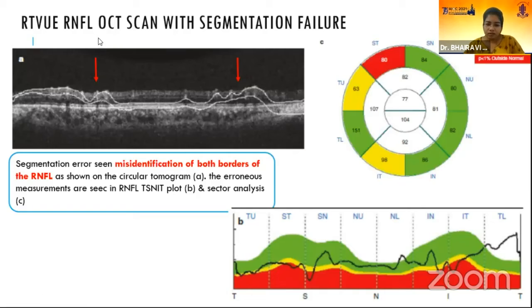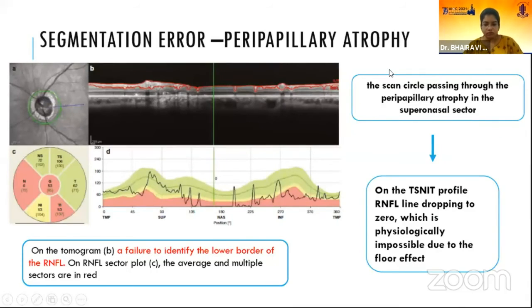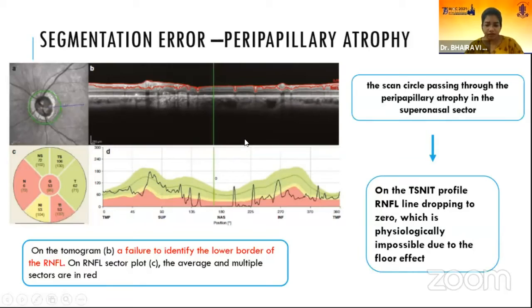This is an RTVue scan showing segmentation error due to misidentification of both borders of the RNFL, causing an abnormal RNFL graph and abnormal RNFL profile. This is a segmentation error due to peripapillary atrophy, where the scan circle is passing through the peripapillary atrophy in the superior nasal sector, causing failure to identify the lower boundary of the RNFL.